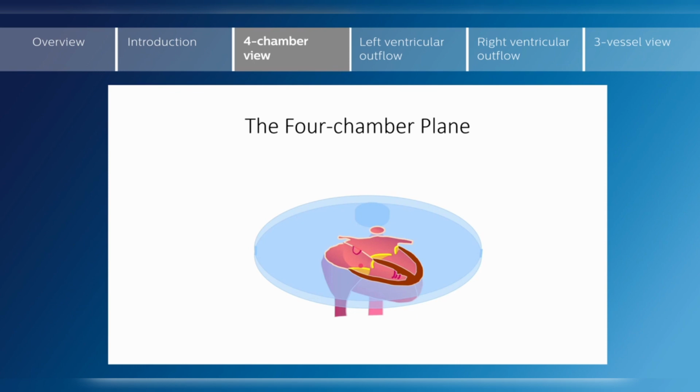in the fetal thorax. And we can name the structures as we've seen from the previous diagrams, with the left atrium most posterior, nearest to the aorta and spine at the back, and with the right ventricle most anterior. And with knowledge of those structures, we can therefore name the right atrium and the left ventricle as shown. We will perform the scan by sweeping from the four-chamber view to see views of the great arteries.